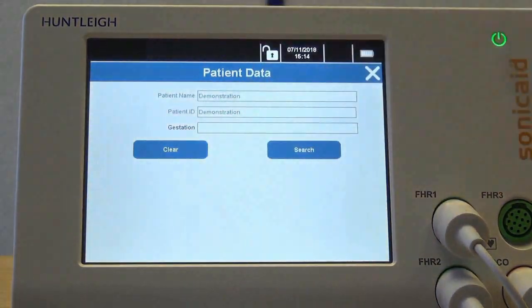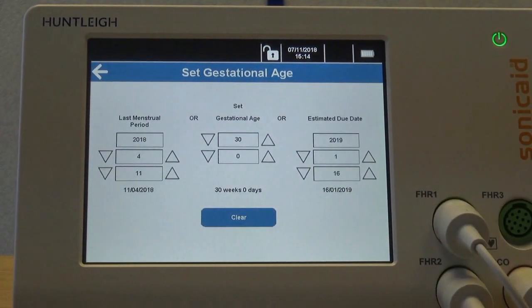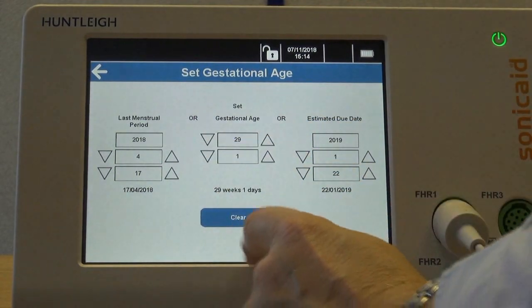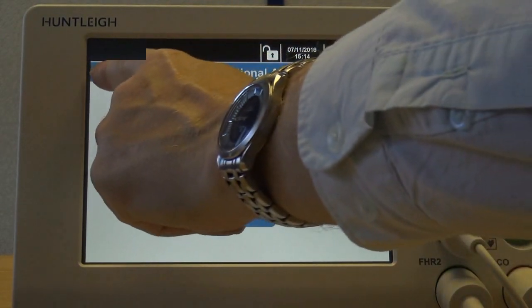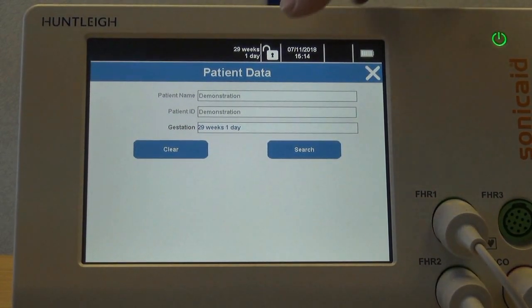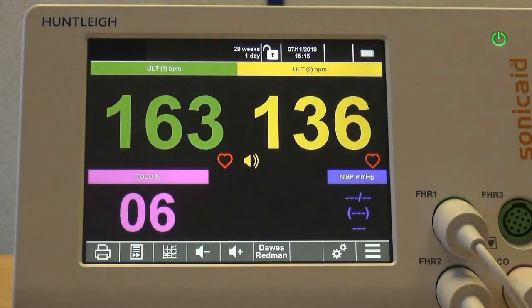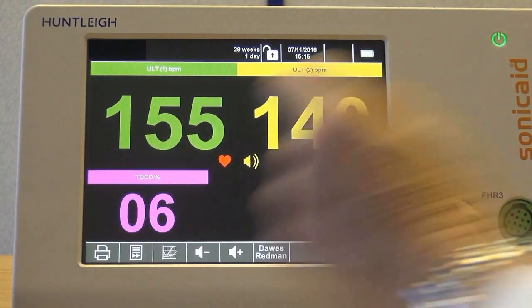Gestational age is set by clicking the top of the screen as shown, selecting the gestation field and entering either the gestational age, the date of the last menstrual period, or the estimated due date. Entering any one of these will automatically update the other two.